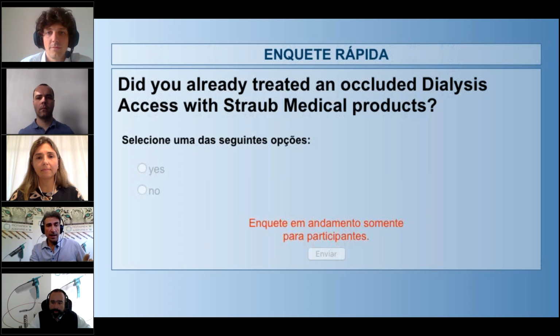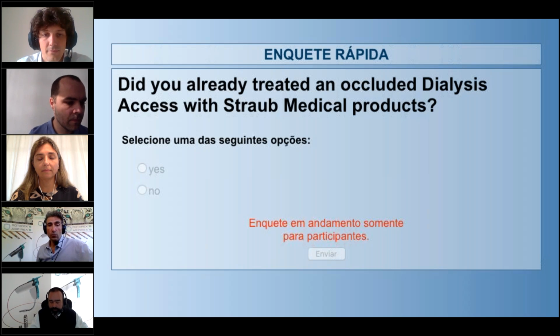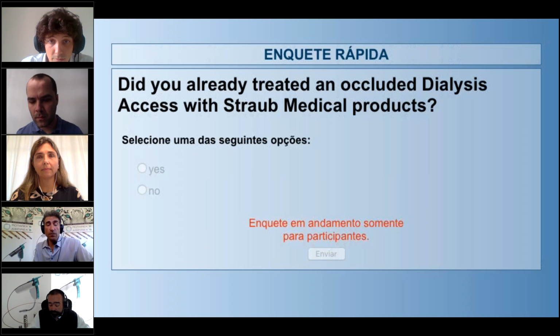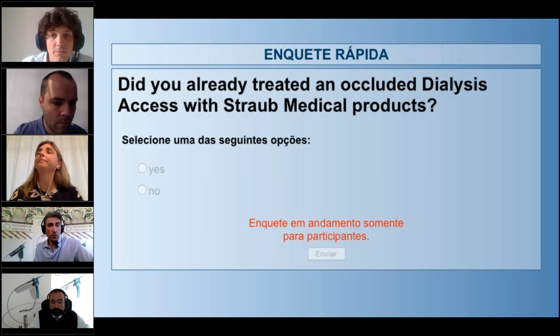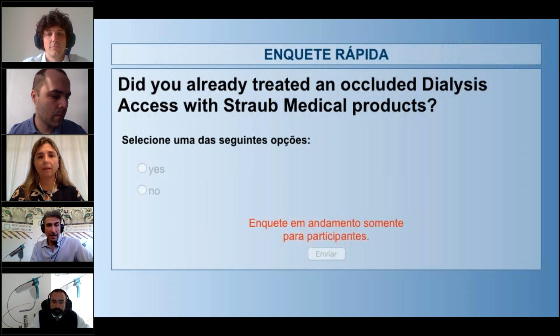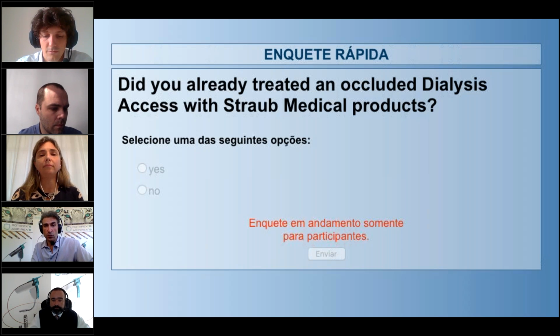In the meanwhile, while we are waiting for the result of this poll, I would like to ask Dr. Carlos Andre if he has another opinion, or if he wants to ask something about the infusion. We know that to always have flow at the catheter head is so important to avoid heating of the system. We also always have to pay attention to distal embolization. We don't want to infuse too much fluid, to avoid embolization at the hand level, which is very hard to manage. What do you think, Dr. Carlos?